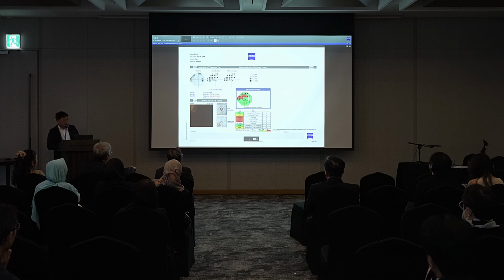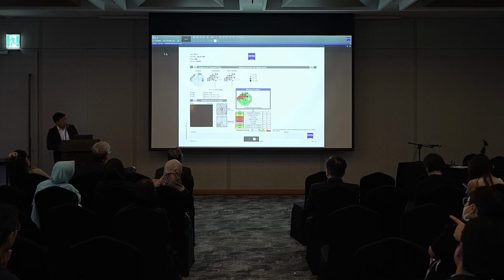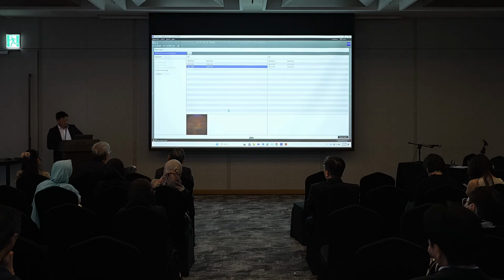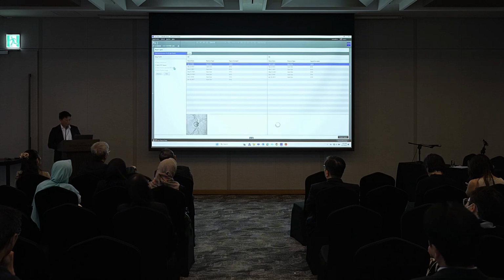And so here we can see, once again, we did the report for the right eye, we've got the visual field structure function analysis. And here I chose this on purpose because, if we go back to our original Clarus image, the weakness here is that this is artifact, right? Just as a word of warning, my patients typically aren't dilated when they have the Clarus, but if you want a good image, do think about taking the photos with the patients dilated at baseline, if that's okay.